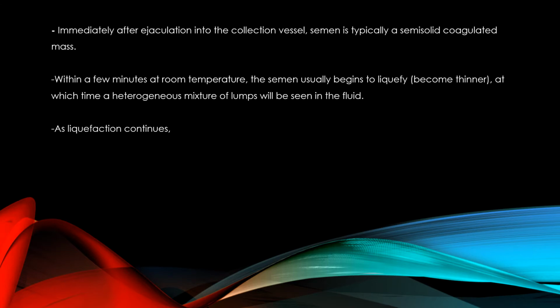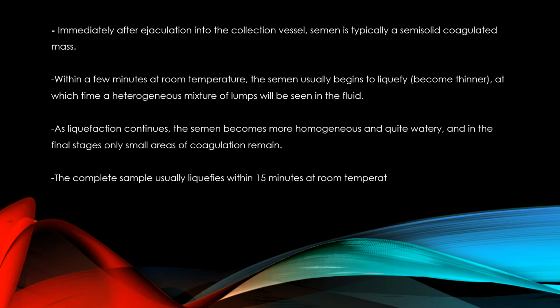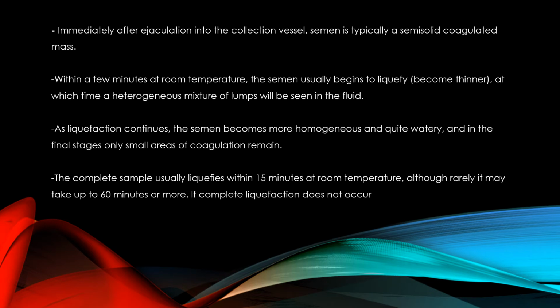As liquefaction continues, the semen becomes more homogeneous and quite watery, and in the final stages only small areas of coagulation remain. The complete sample usually liquefies within 15 minutes at room temperature, although rarely it may take up to 60 minutes or more. If complete liquefaction does not occur in 60 minutes, this should be recorded.